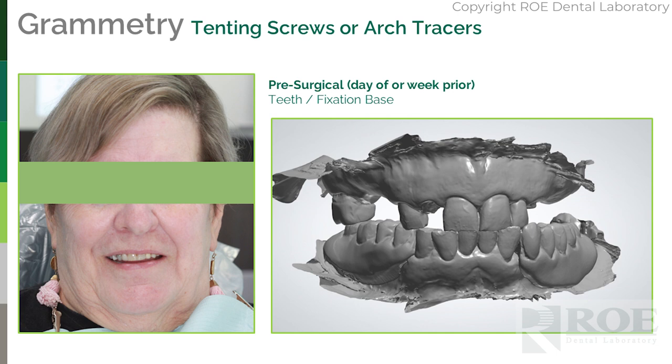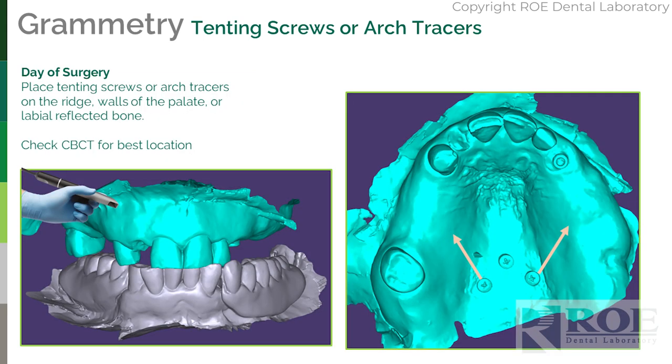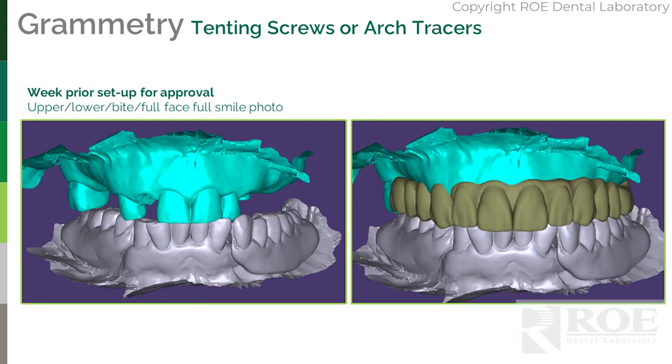Then put the screws in and scan. Now, I'm going to give you a little different option here that is being taught in a lot of these courses. The week before, 2 weeks before the patient comes in, scan the upper, scan the lower. We will design you a smile. We can give you some idea of bone reduction levels if you'd like. We can give you tooth position.